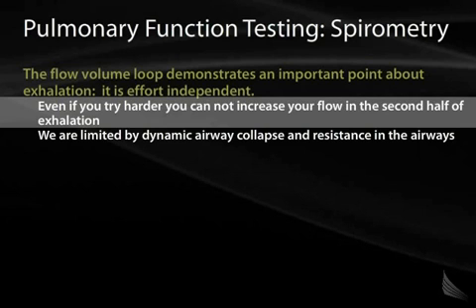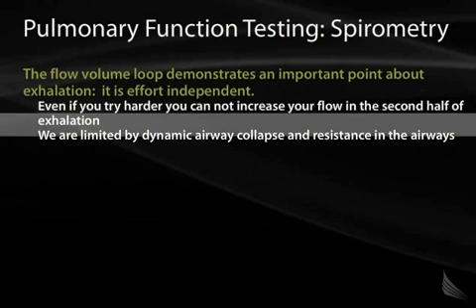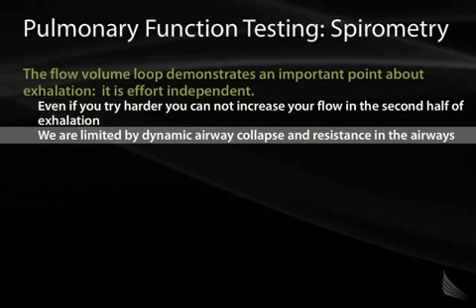is effort independent. And it's important because the end of exhalation is a process of airways collapsing, this process of dynamic airway collapse. So no matter whether you're faking it or whether you're trying your hardest, that descending portion of exhalation will always look the same. That is not an effort-dependent process. And this can be important as we try to interpret a test to look to see if someone's trying their hardest.